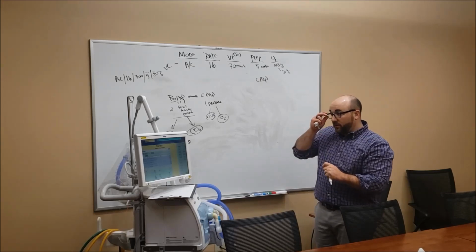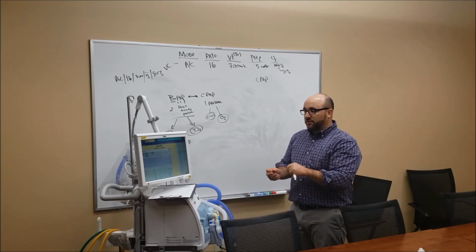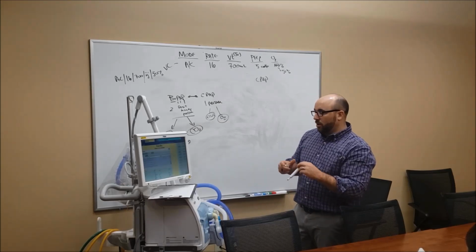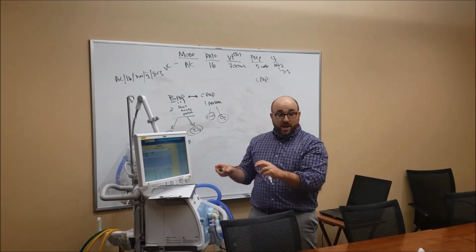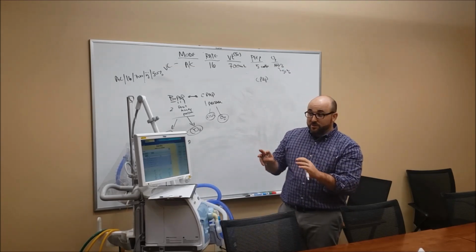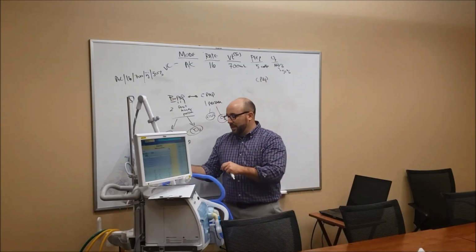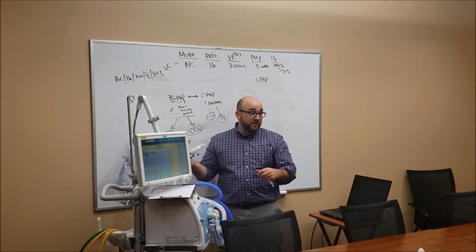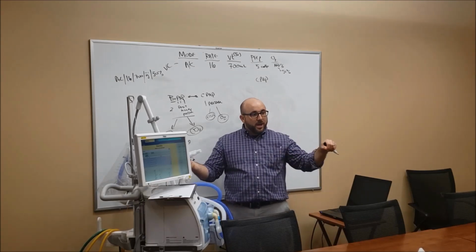It's really important if you hit that button and you go to suction, and you suction, you come back, that's just fine. But let's say you go to suction them, and somebody calls you away and you don't suction them yet, the machine's waiting for them to be suctioned. In other words, it's waiting for them to be off the vent because it senses them being off the vent when you suction because you're pulling the volume away.